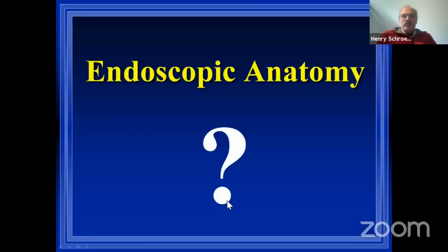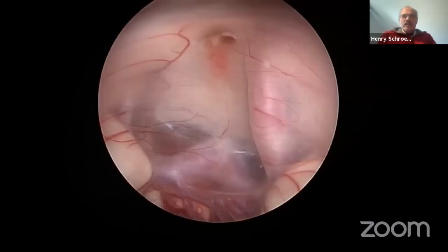So now some questions for you. What is this structure?